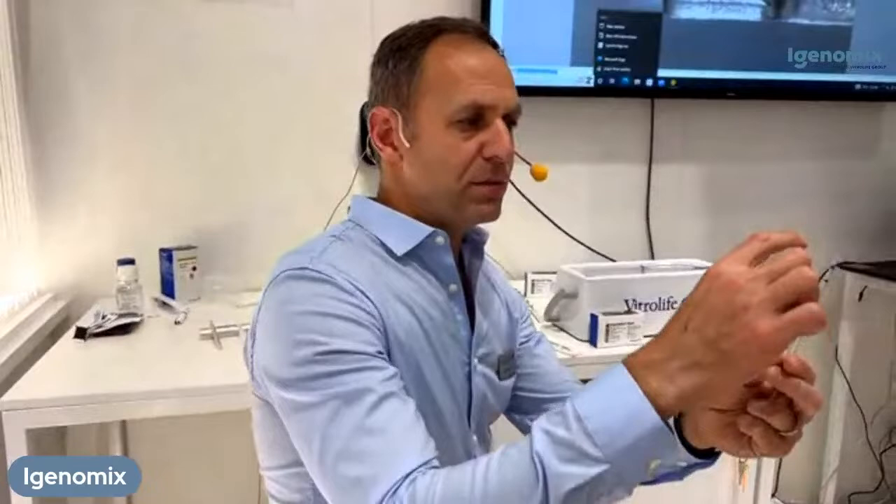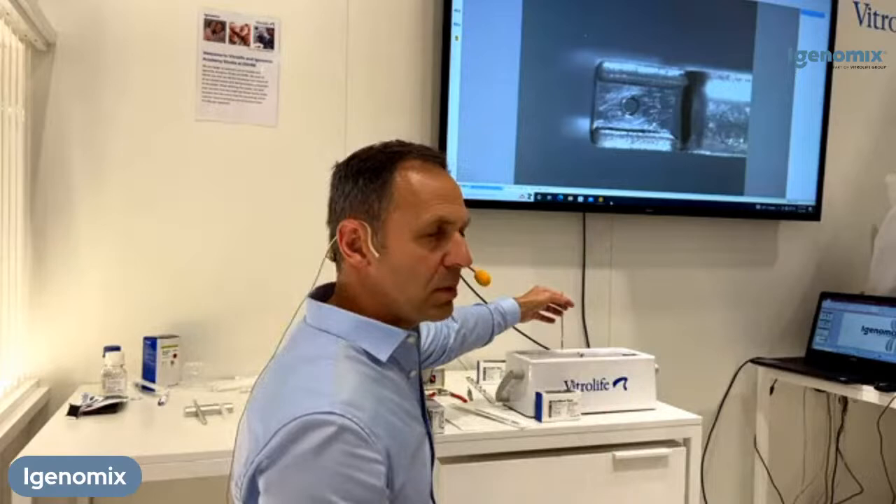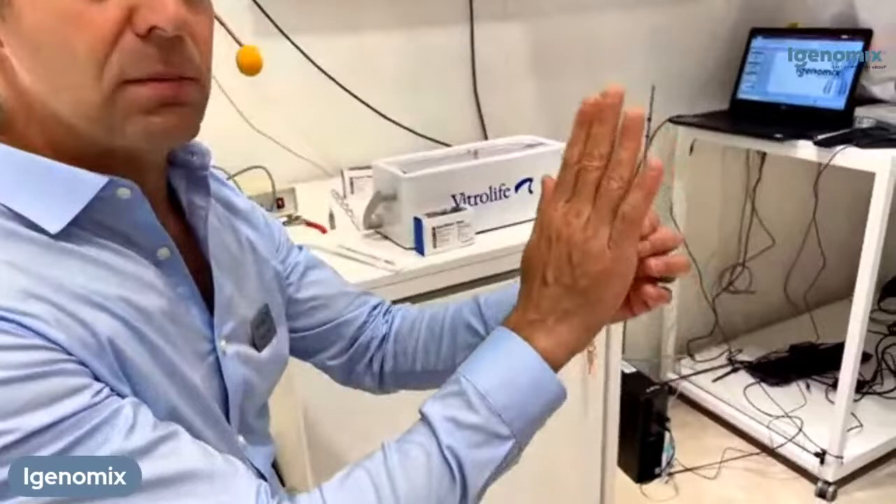Another part of the package is the metal rod. First of all, you will eventually do the vitrification inside the straw and we want to make sure it's not bent or kinked — having the rod inside prevents that kinking. The other and most important reason is that when you work in your laboratory there is water vapor in the air. When you place it inside your smart box, that very cold temperature on the outside, if you expose the inside of the straw to atmospheric air, you could have condensation falling inside. So during the process you leave the metal rod inside, and once you're ready for vitrification you remove the rod and perform the loading.